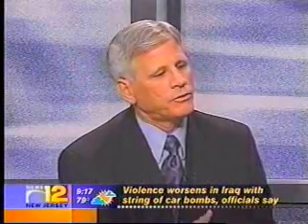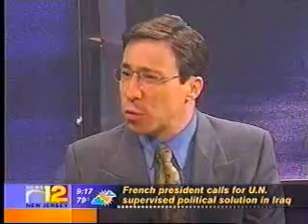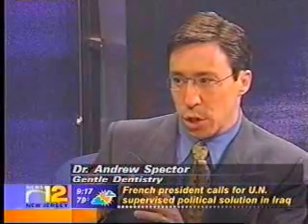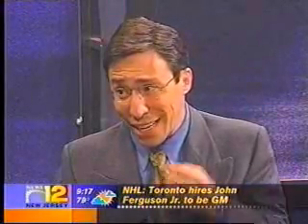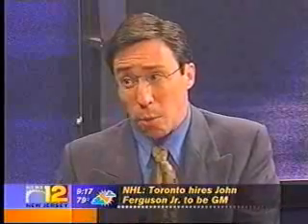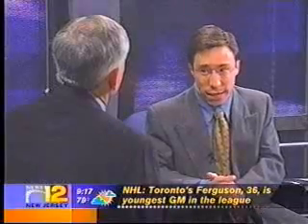Now, with this, and you mentioned you're not taking as much of the tooth. Does that bring into play that you might not even need anesthesia? Not that conservative. Once you need this kind of porcelain restoration, your tooth's pretty broken down. This is at least half of your tooth is gone. There are techniques for very small fillings now, as we've discussed in the past, whether it's laser or microabrasion, where you can get away with doing a small to moderate filling without anesthesia. But quite honestly, once you get into that dentin layer, the second layer of the tooth, most of the time you're going to need to be numb. It has to be a pretty conservative filling for you to be able to get away with it without anesthesia.